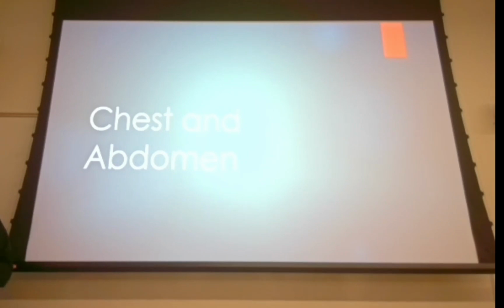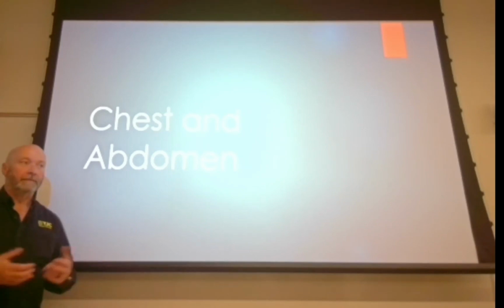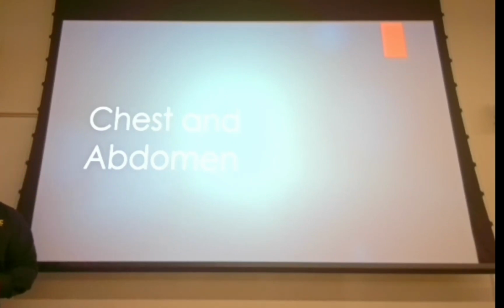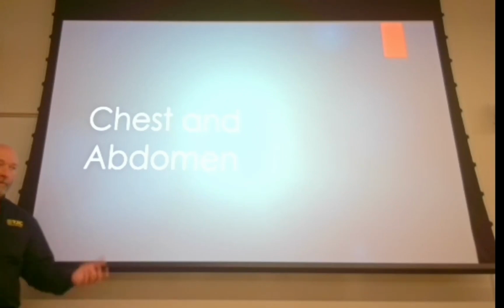Some things are things that if you were to go back and repeat the image, it would be not just counterproductive, but it would be bordering on medically unethical to reshoot. For example, if you failed to collimate enough, so you overexposed the patient, it'd be ludicrous to go back and reshoot that a second time and not only overexpose the patient the first time, but also repeat the exposure and double the dose. So you would be not only double dosing the patient, but over double dosing the patient.